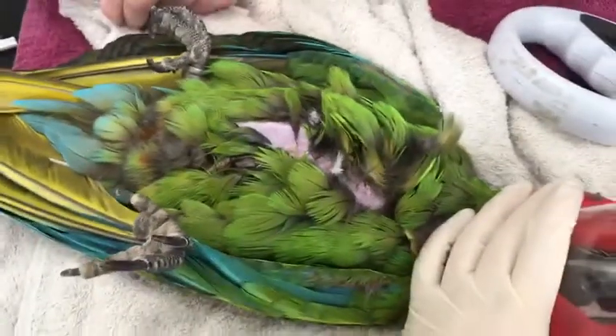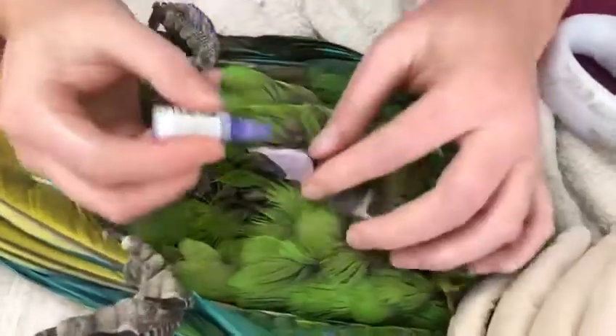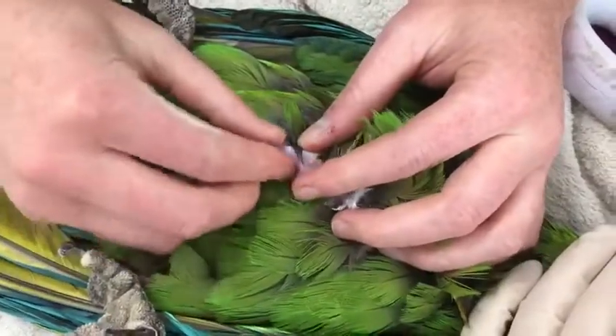All we want to do is pop a little bit of tissue glue on the site and pinch that skin closed, and that's it.